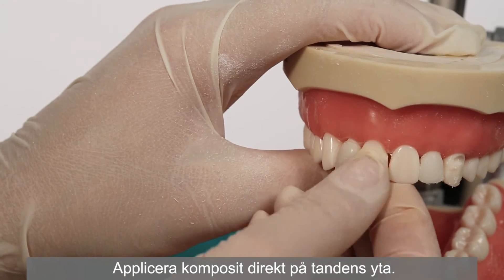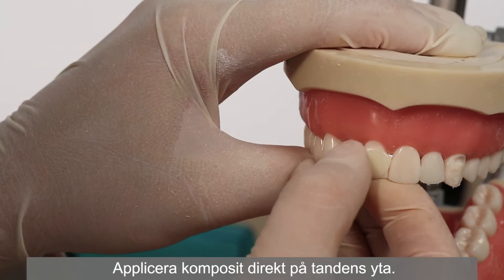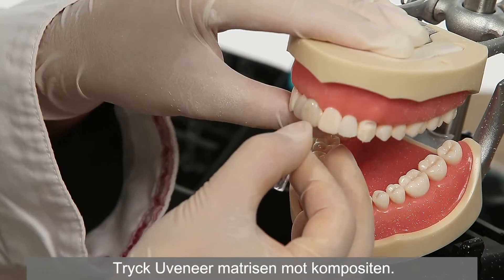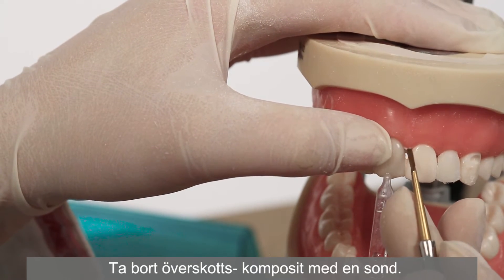Apply composite directly to the tooth surface. Press the Uveneer template onto the composite. Remove excess composite from the periphery with a probe.